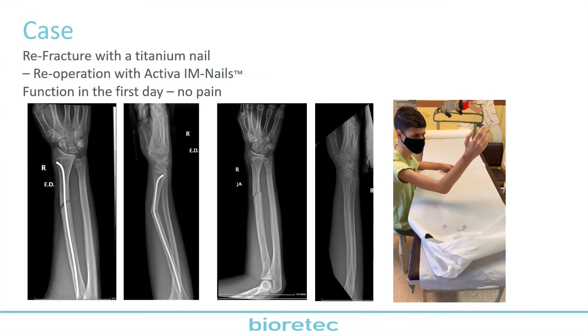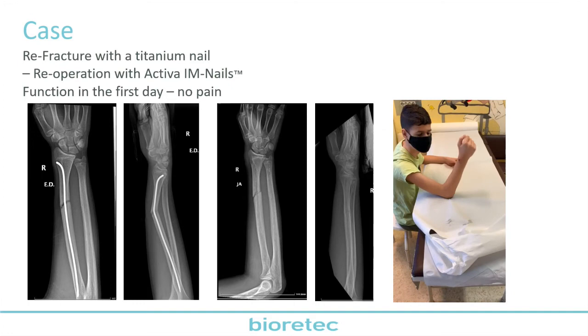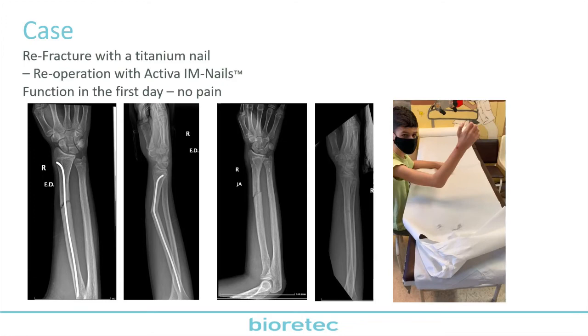And the picture that we can see is after 1 day of operation. Of course, this state without the cast was only for the video.